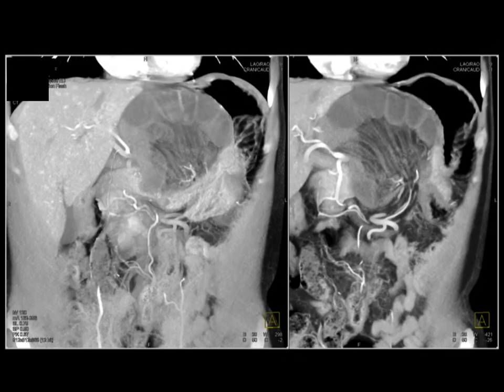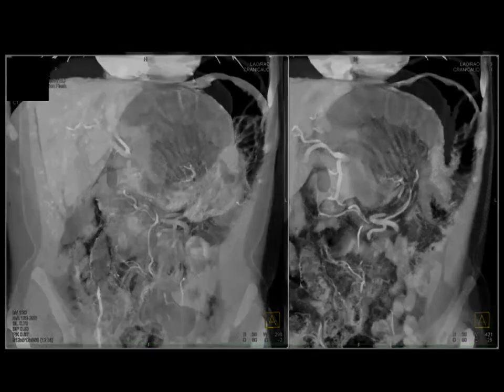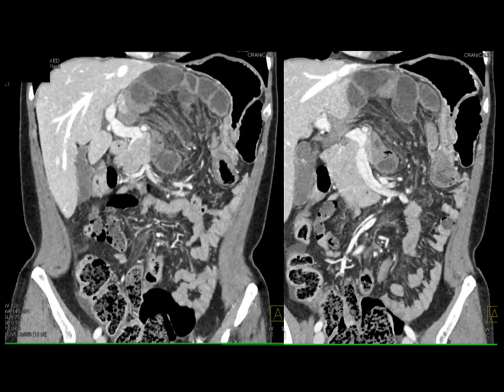With volume rendering and MIP, these are beautiful examples of the 3D map. It's important to recognize these findings so you make a rapid and early diagnosis — this patient needs to go directly to surgery. If the patient diddles around, this patient could die.